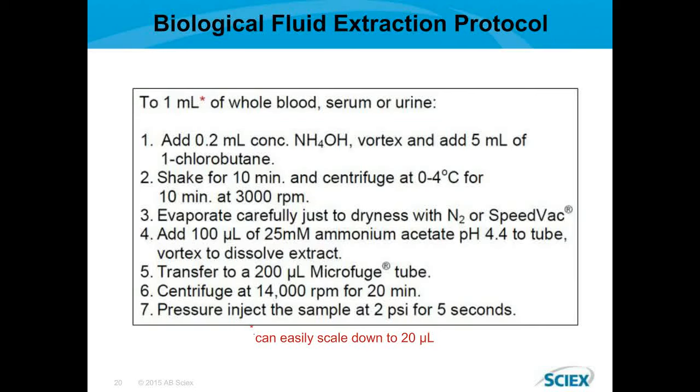The extraction protocol is quite a simple extraction protocol, which is used widely around the world. It's a liquid-liquid extraction protocol, which can be used on either whole blood, urine, serum, plasma, or oral fluids. The thing to note here is that the protocol shown suggests 1 mL. This can easily be scaled down to a few microliters, down to 20 microliters or even less, with no changes to the actual protocol itself. The final sample is dissolved in 100 microliters, so we are injecting nanoliters from 100 microliters, and you'll see a calculation at the end of my talk.